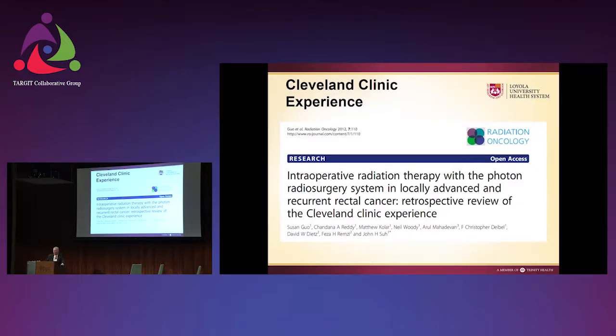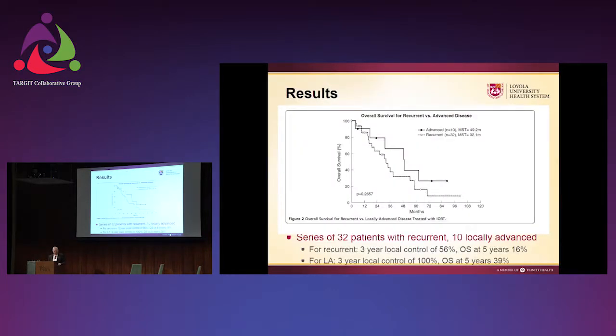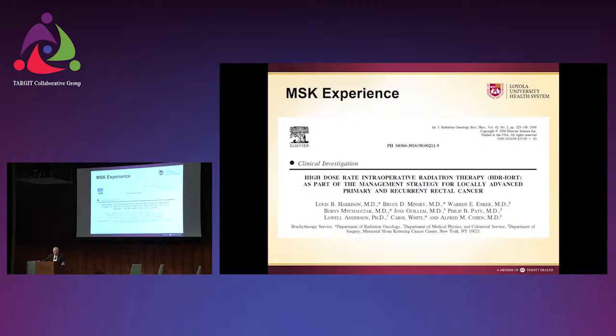If I'm not unaware of others, I think this is the only publication on using Intrabeam in colorectal cancer. And with our colleagues from Cleveland Clinic, we're collaborating, or beginning a registry study, on collecting data in rectal cancer. Again, this was using the Intrabeam device as the treatment. It's a very big hodgepodge of patients, suggesting a 3-year local control rate of 56%. I showed you some which was 30% or 37%, suggesting that this may be better than what was done in the past. And again, this is high dose rate.